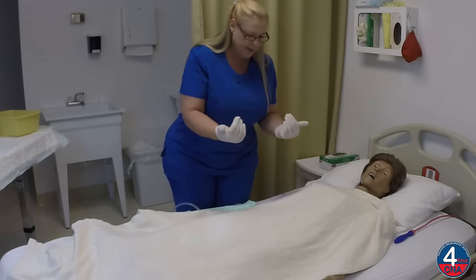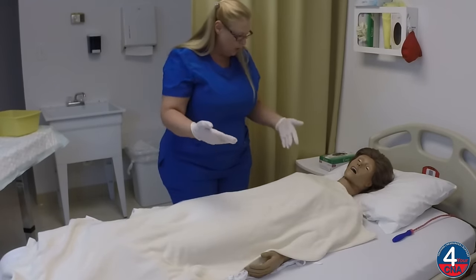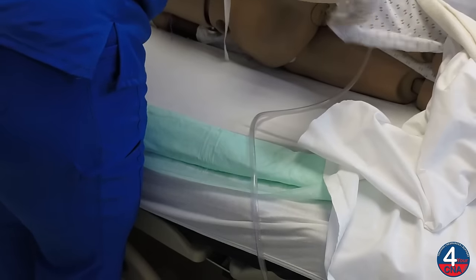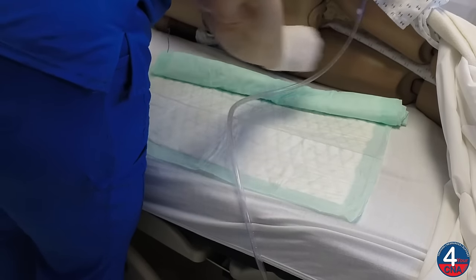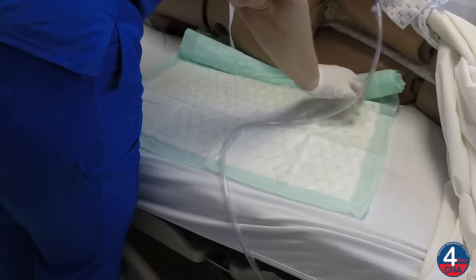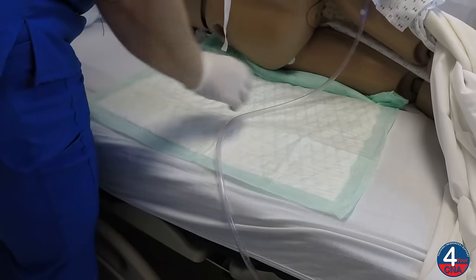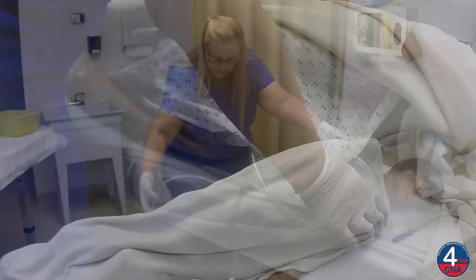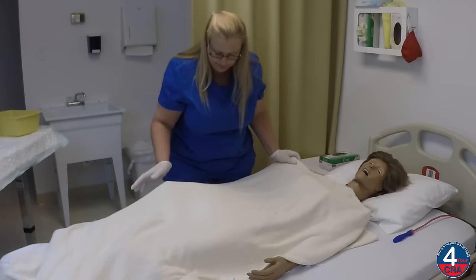All right, Ms. Jones, can you scoot toward me, please? Thank you. And can you roll onto your left side? One, two, three. Thank you. I'm going to be very careful, making sure that the catheter tubing rolls with the patient and doesn't get pulled on. I'm going to unroll the chucks underneath the patient's hip and have the patient come back onto their back, making sure that they don't lay on that catheter tubing.